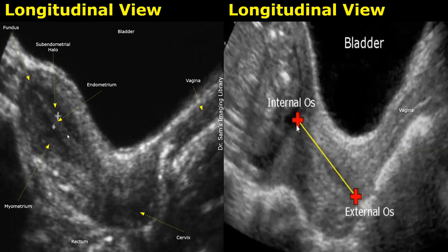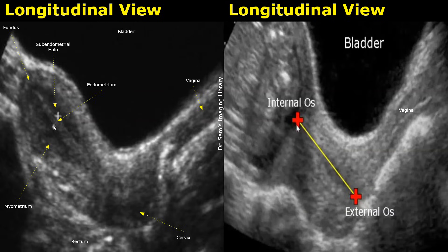This echogenic line is the endometrium. It is the innermost layer of the uterus, and it is surrounded by a hypoechoic layer called the subendometrial halo. This is actually the innermost layer of the myometrium, also called the junctional zone. Myometrium is the second layer of the uterus — a thick muscular layer with medium level echogenicity.